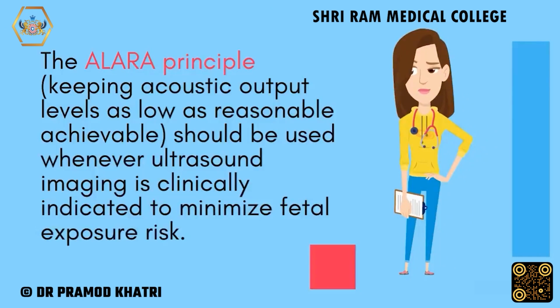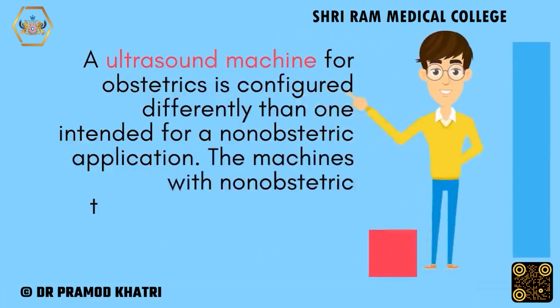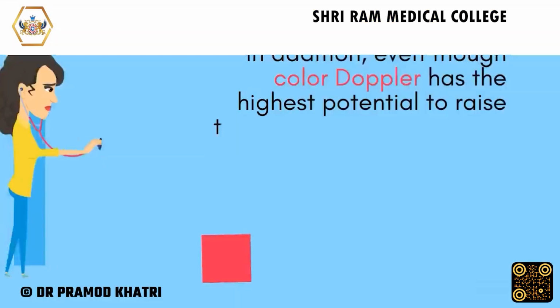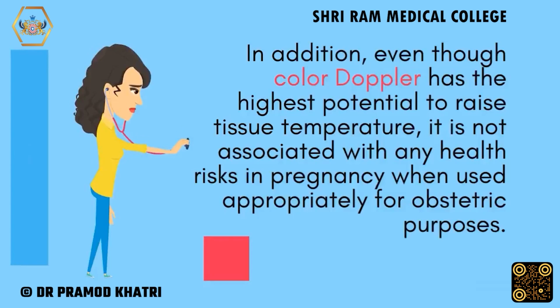The ALARA principle, keeping acoustic output levels as low as reasonably achievable, should be used whenever ultrasound imaging is clinically indicated to minimize fetal exposure risk. An ultrasound machine for obstetrics is configured differently than one intended for a non-obstetric application. The machines with non-obstetric transducers and settings deliver higher temperatures. In addition, even though color Doppler has the highest potential to raise tissue temperature, it is not associated with any health risks in pregnancy when used appropriately for obstetric purposes.